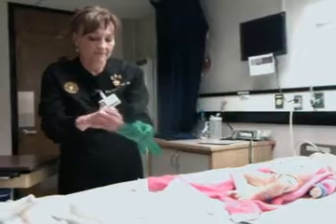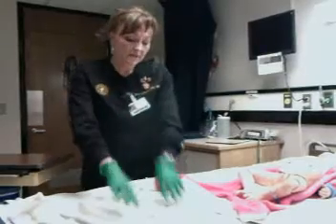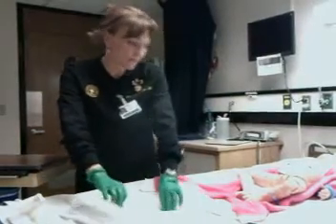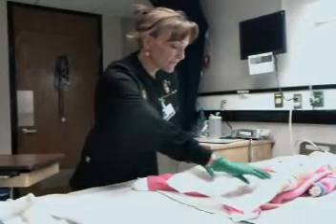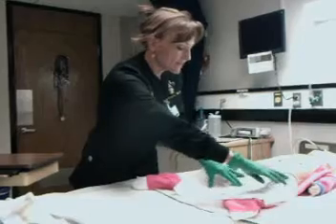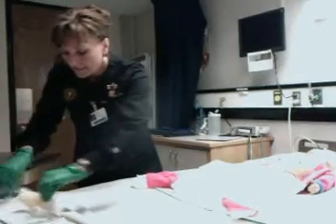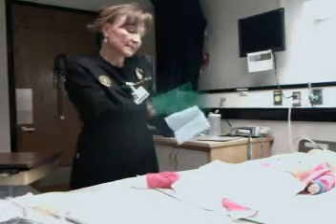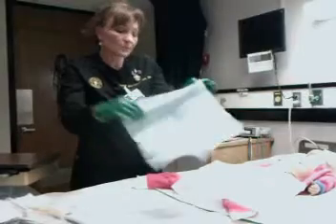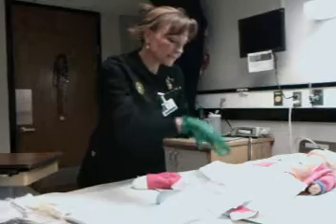Now, truthfully, you can see the position of the baby — that kind of frog leg position. I can lay this over; there's a diaper underneath the baby to try to give me as sterile an area as possible. I'm going to open up my kit now, and I also have another drape we could try to lay underneath the baby, which would give you another option. This is going to be a little bit difficult because I might have to reach under, so I would have somebody lift the baby up and tuck this underneath to give us more room.